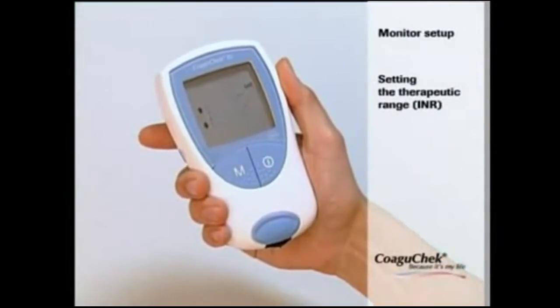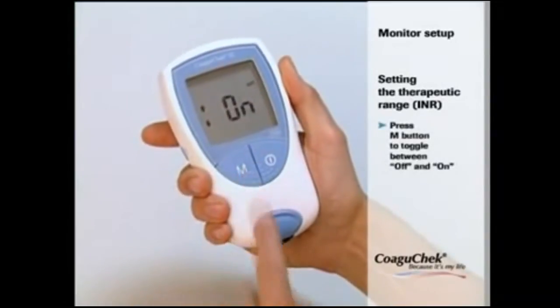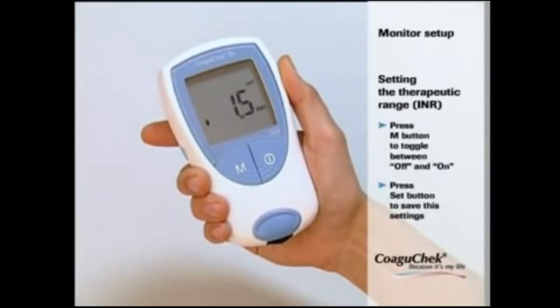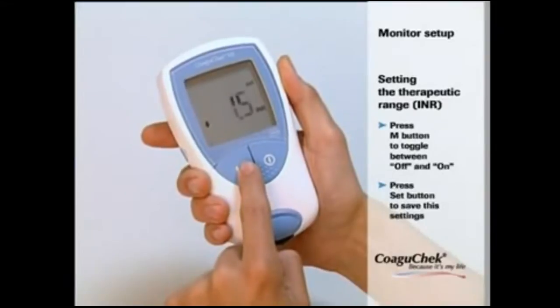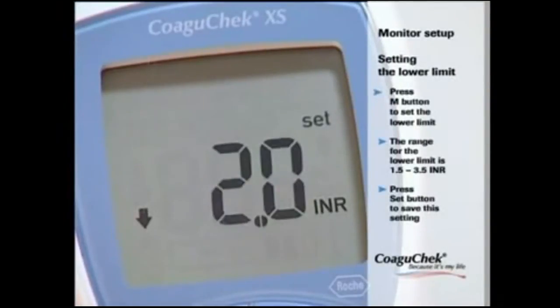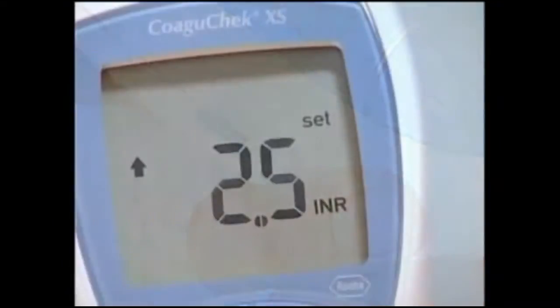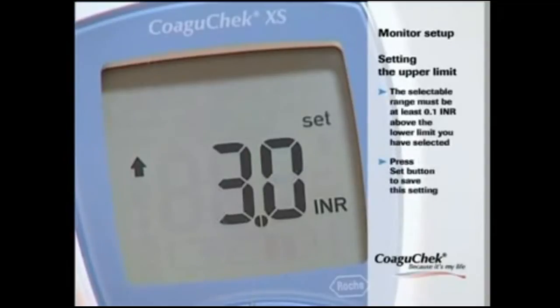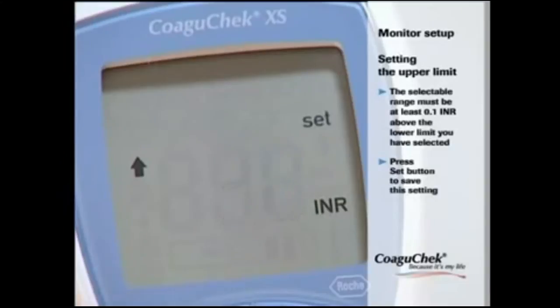If you selected the unit INR, you can choose whether you want an additional element displayed that shows if the result is above or below your therapeutic target range. Press the M button to toggle between off and on, then press SET to save. If you activate this function, press the M button to set the lower limit within the range 1.5 to 3.5 INR, then press SET to confirm. Now press the M button to set the upper limit within the range 2.5 to 4.5 INR — the value must be at least 0.1 INR above the lower limit. Press SET to confirm.